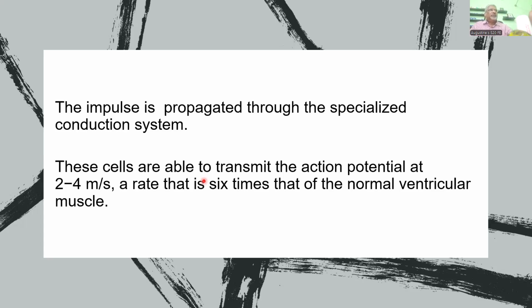So what is the clinical implication? If the QRS is narrow, what can you say 100%? There is no problem anywhere in the conduction system, no conduction block anywhere. The impulse is traveling perfectly along the pathway, so your QRS is narrow. If the QRS is wide, what can you say 100%? There is some block somewhere. Without that, the QRS cannot become wide. So a narrow QRS tells you that the impulse is traveling along the specialized conduction system without any block. If it is wide, that tells you that there is a problem or a block in the conduction system. It could be at the bundle of His, the left bundle, the right bundle, anywhere. We will teach you subsequently how to recognize that.